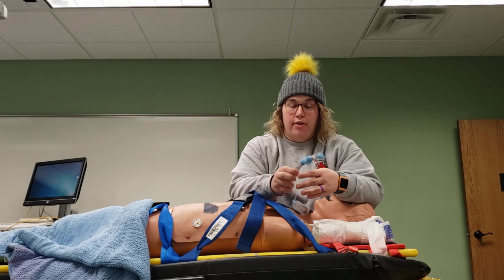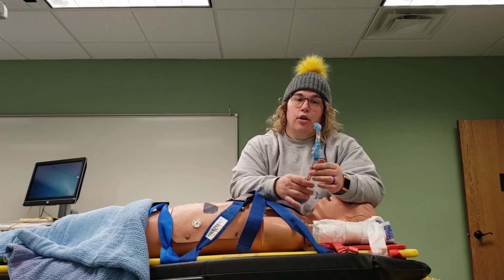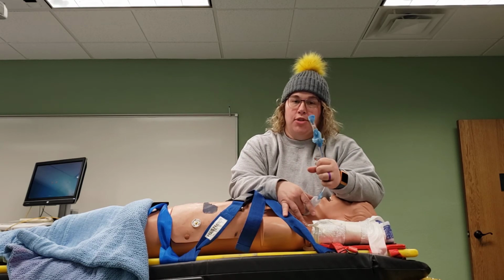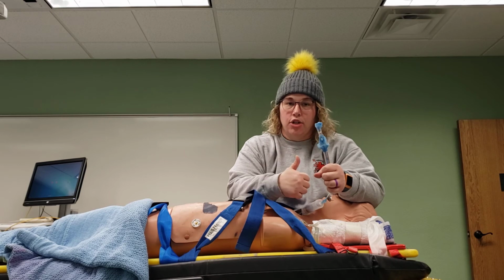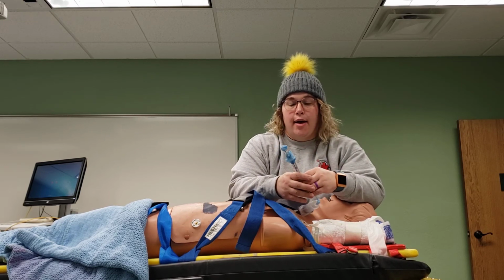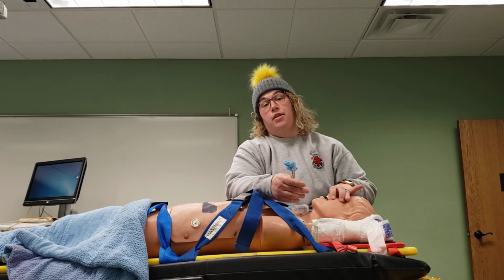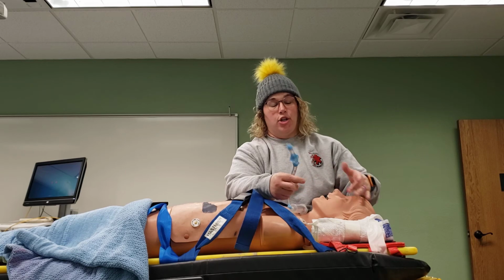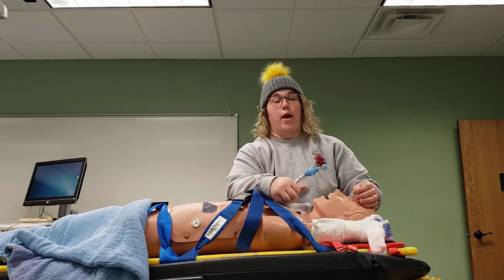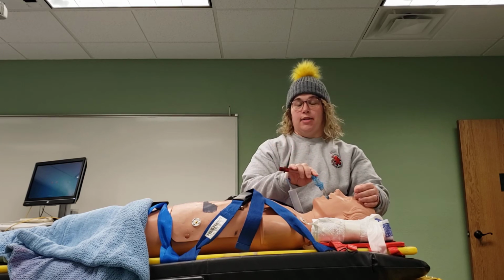Otherwise, anytime you put an advanced airway in, what we want to see is you having all your other plans in place. So this isn't going to protect you or be able to suck up vomit. So you want to have suction at the ready. You want oxygen flowing at a high rate. Maybe you were doing CPR with a nasal cannula at 15 liters, and that's how you're oxygenating the patient. Keeping that going. Having a BVM ready. Don't wait until this airway goes in to get your BVM out, because that's not going to be acceptable.